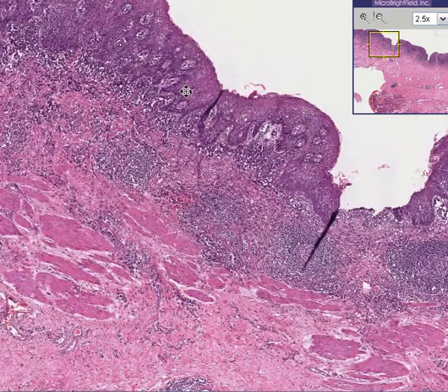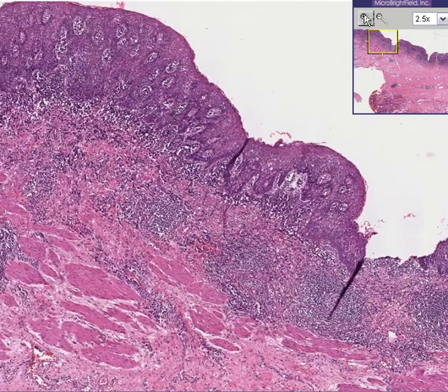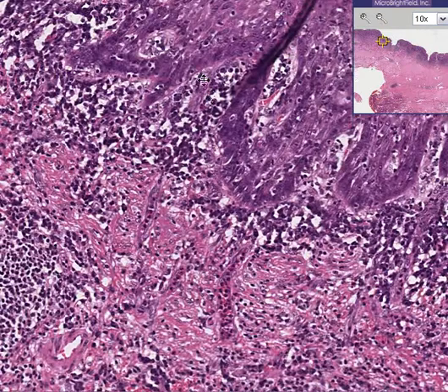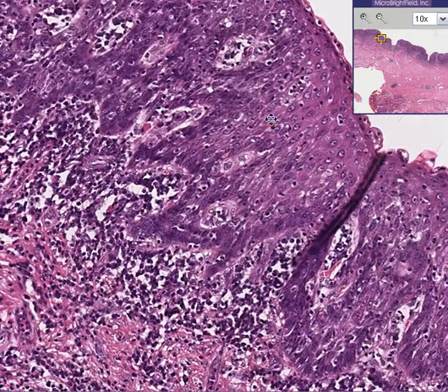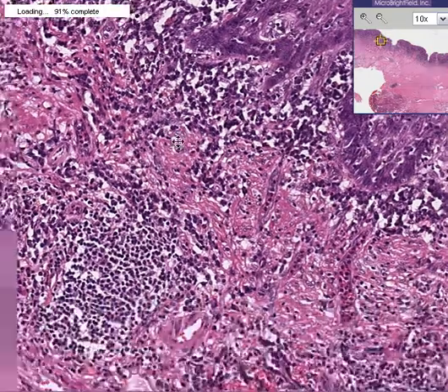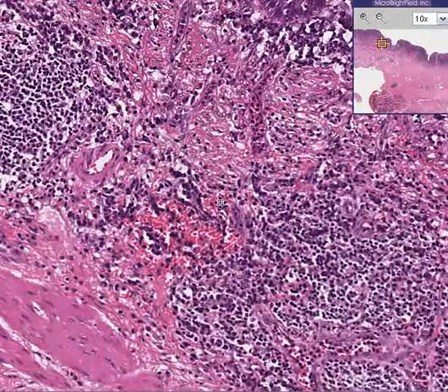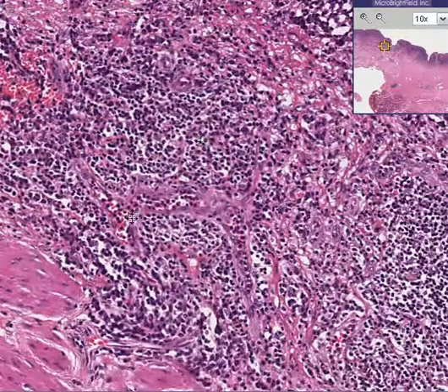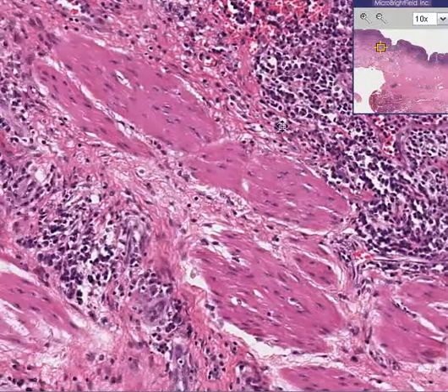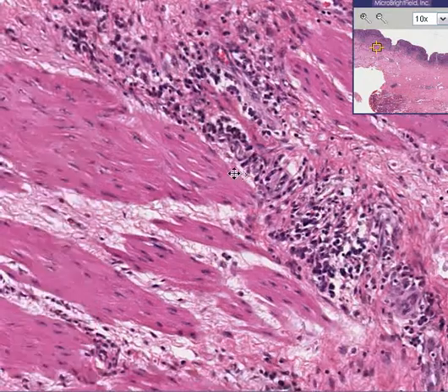The main thing you can notice from this esophagus is that there is a very heavy infiltrate of chronic inflammatory cells, i.e. chiefly lymphocytes, not only in the lamina propria portion of the mucosa, but also occasionally interspersed here throughout the epithelial layers as well. In addition, the submucosa is loaded with lymphoid cells, both loosely as well as forming nice follicles. You can also see that perhaps some of this inflammatory infiltrate does infiltrate through the smooth muscular layers as well.